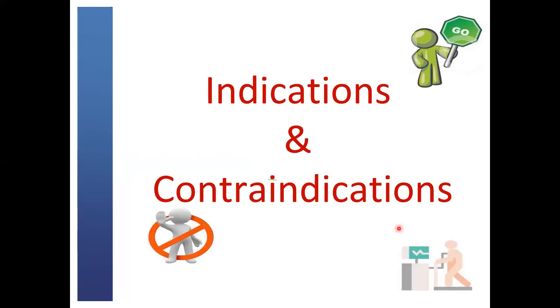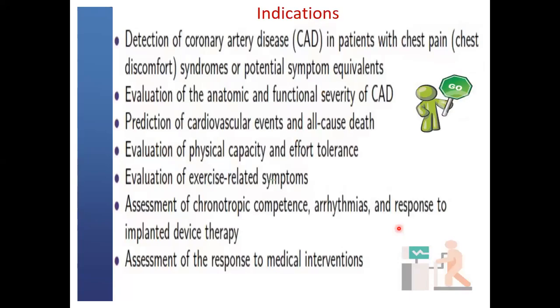So moving on, we're looking at indications and contraindications of exercise stress testing. Some of the indications include detection of coronary artery disease in patients with chest pain, chest discomfort or syndromes, or potential symptom equivalents. It can also be used to evaluate the anatomic and functional severity of coronary artery disease.